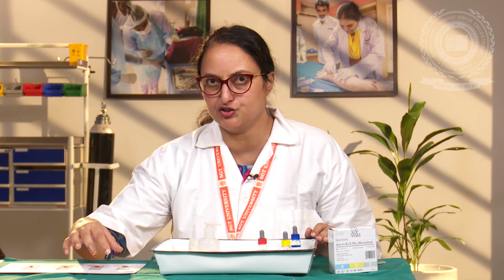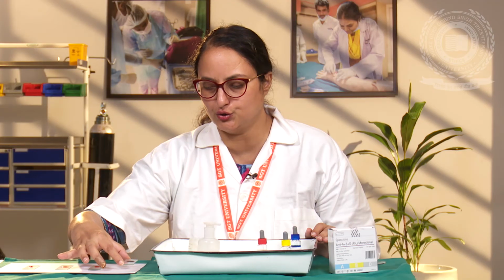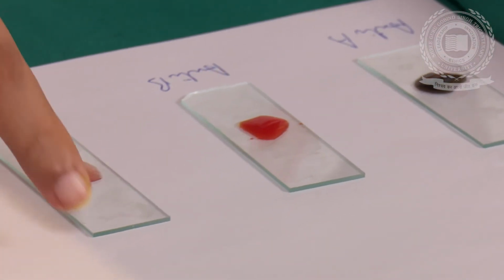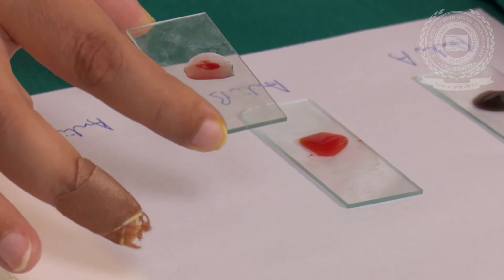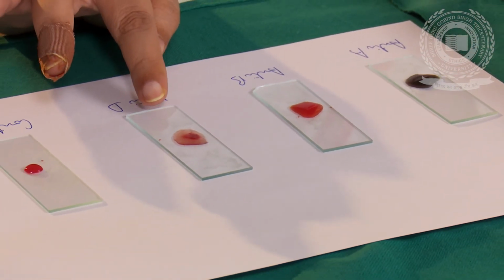We have waited for 10 minutes. We check for the antigen-antibody reaction by slightly rolling the slide like this. This slide does not show clumping as the solution is clear. This slide also does not show clumping as the solution is clear, and this slide shows clumping, as in this slide the antigen-antibody reaction has taken place.